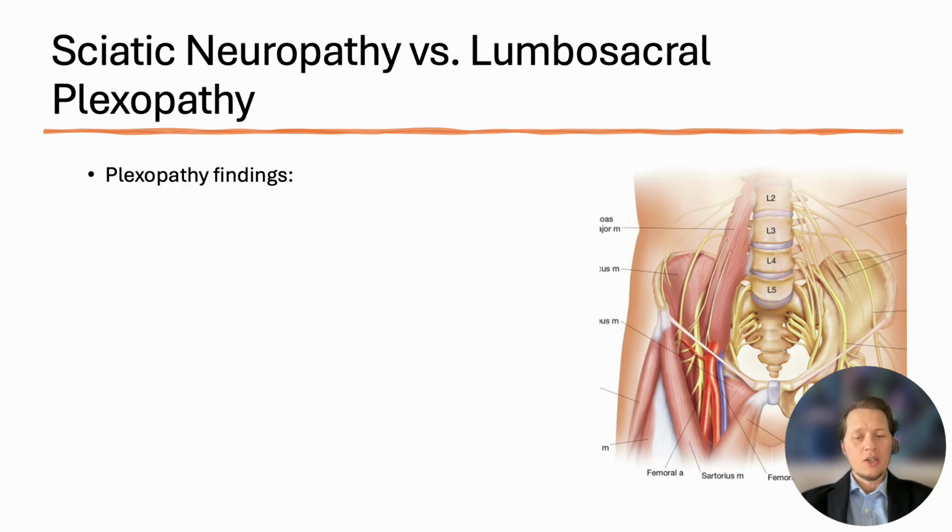This is the trick and difficulty with lumbar and lumbosacral plexopathy. You have to have a high index of suspicion. And in theory, somewhere down along this course, as these nerves are coming together, things could have been injured. When we typically think of a plexopathy, though, we think of hematoma from some abdominal injury and bleeding, where blood is collecting in here and causing a plexopathy.